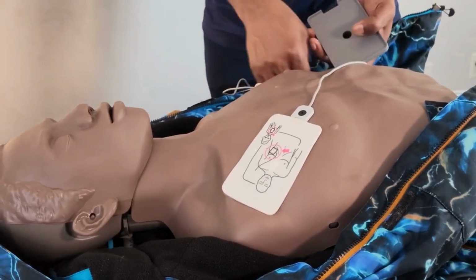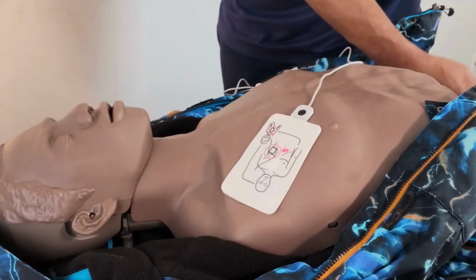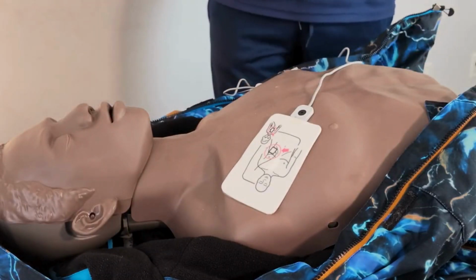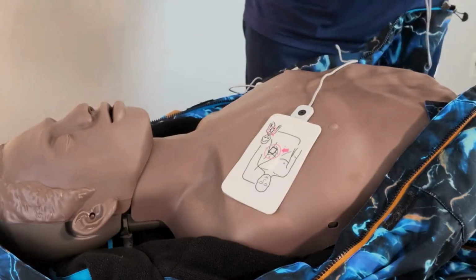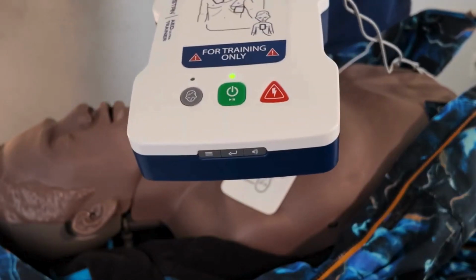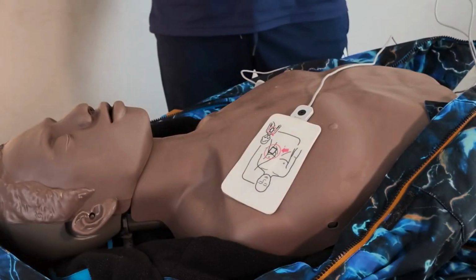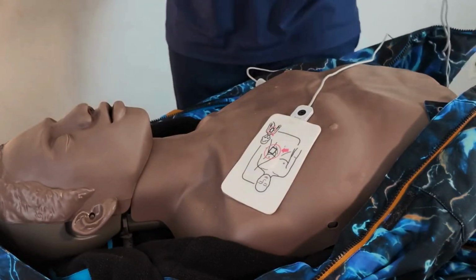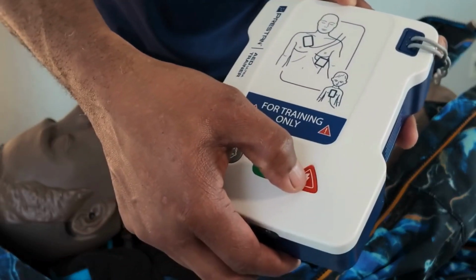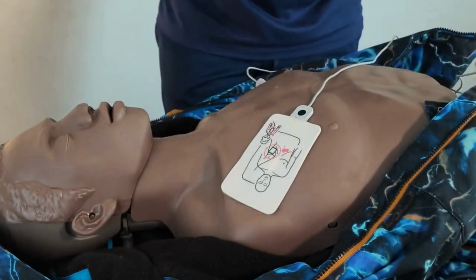Press pads firmly on skin. Do not touch the patient. Analyzing heart rhythm. I don't touch. Do not touch the patient. Analyzing heart rhythm. Shock advised. Do not touch the patient. Everyone clear. Press the flashing shock button. Press the shock button now. Shock delivered. Begin CPR.